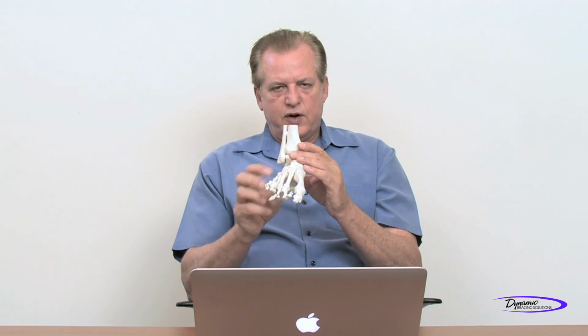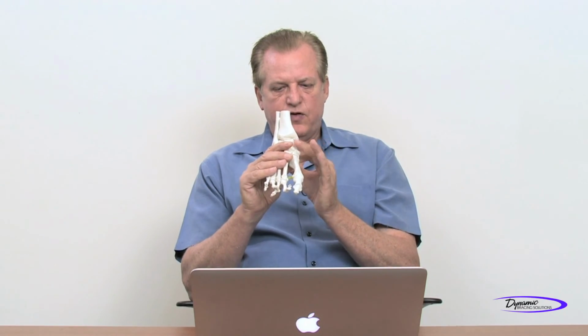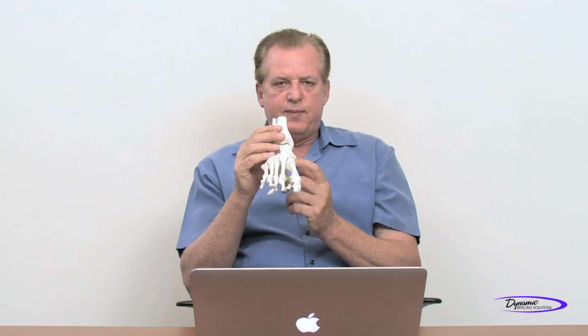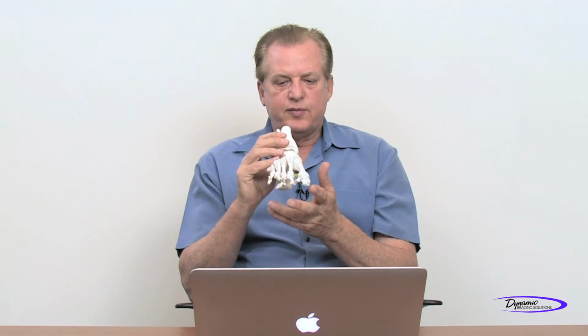And what I found is when we go actually for correction and get full correction, we have gravity on our side and it actually minimizes the pressures within the orthosis. So I find that adding corrective forces in multiple dimensions actually makes it more comfortable once we get them controlled and aligned.